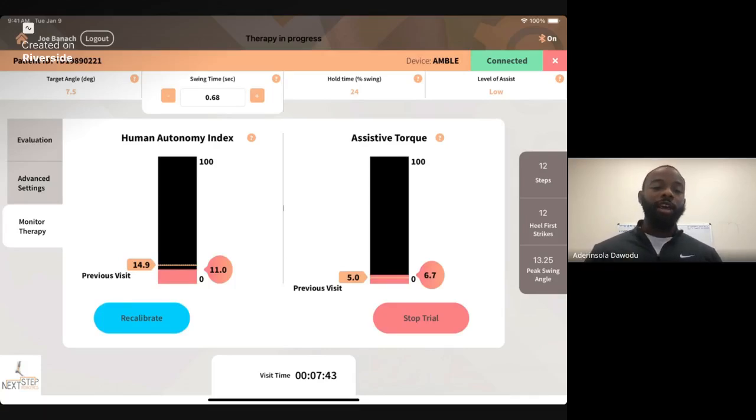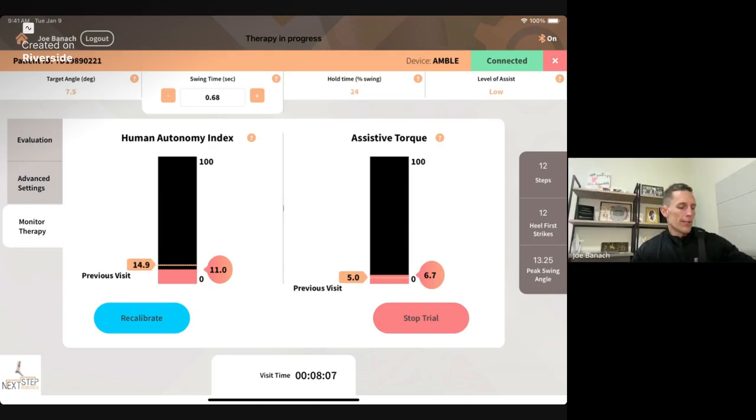So the steps to get you to, let's say, 1.5 miles per hour on a treadmill, it might take someone 7 steps to get to that desired swing. By that time, you're 70% done with the initial evaluation, the walking evaluation, which will make the swing time incorrect. That's true. Okay, that's great advice.